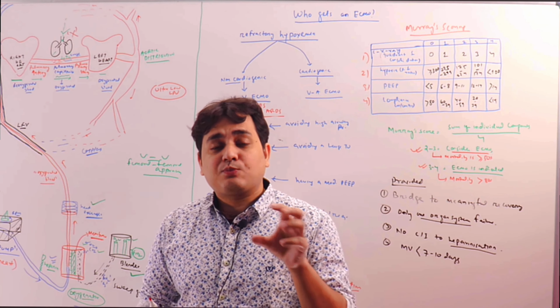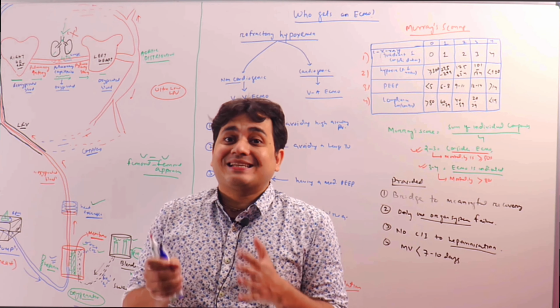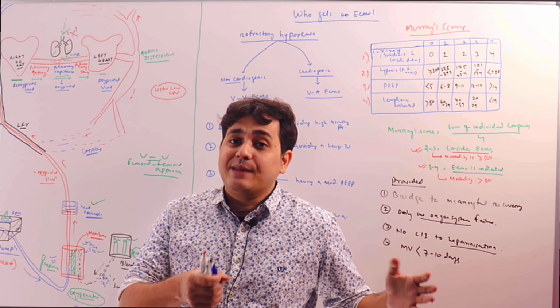So while the patient is put on ECMO, what are the things to set in the ECMO machine? What are the things to set in the ventilator? What are the things to look out for? How to troubleshoot any problem?